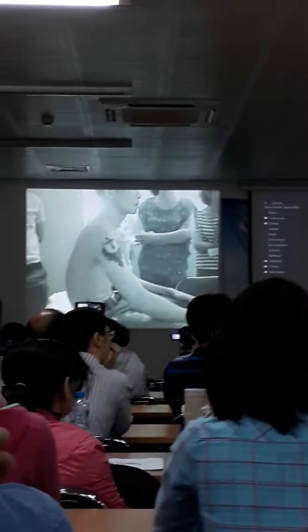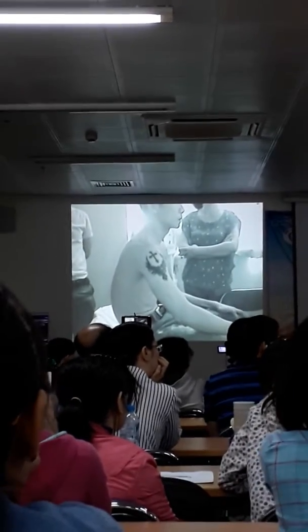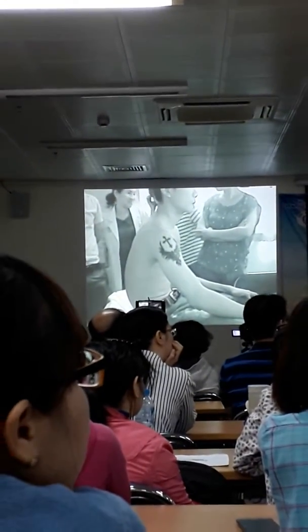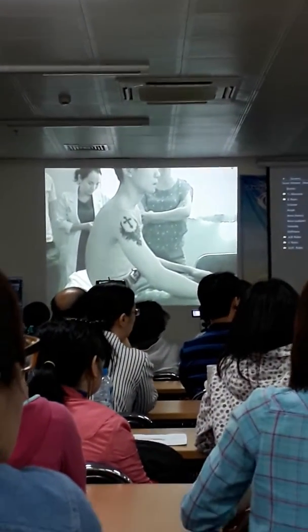So immediately I would be thinking, okay, this is an overuse type injury, so I'm thinking more bursitis as opposed to a tear, because once again he's a young patient, so tears are uncommon in young patients.